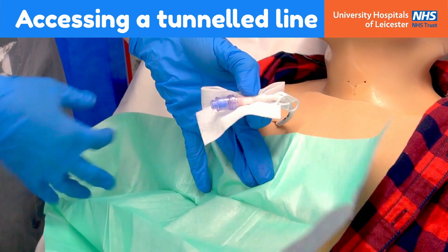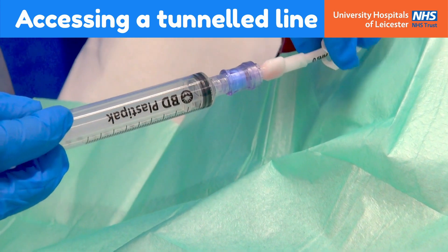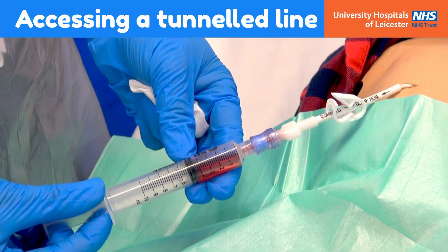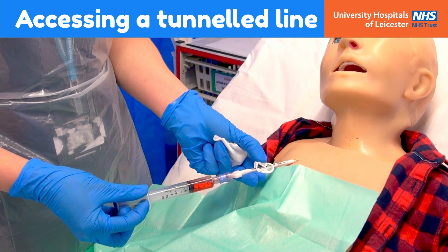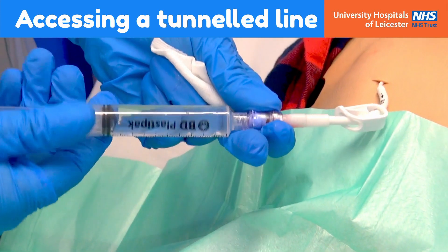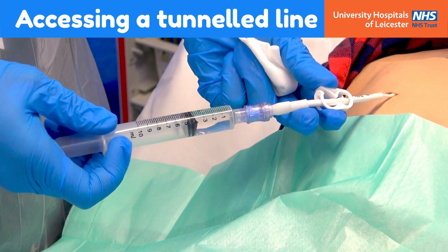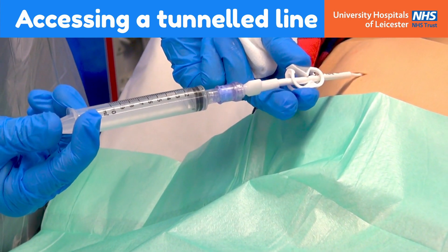Use the green drape to cover the area below. Attach a 10ml LuerLock syringe and unclamp, ensuring that blood is freely aspirating. The initial 5ml of blood can be used for a blood culture or discarded if cultures are not needed. Attach a further syringe if blood samples are required, clamping the line between syringe changes. Then flush with 10ml of 0.9% sodium chloride using the push-pause technique. Follow this with 5ml of heparin sodium 10 units/ml as a line lock if the line is not being used for the next 8 hours. If the patient uses a different line lock, substitute this for the heparin sodium.